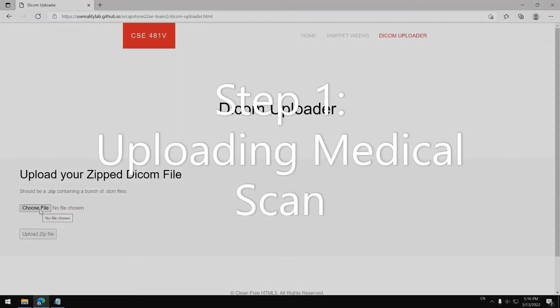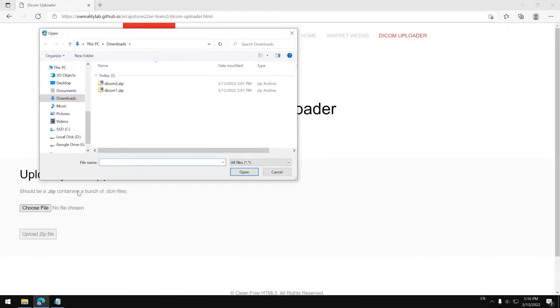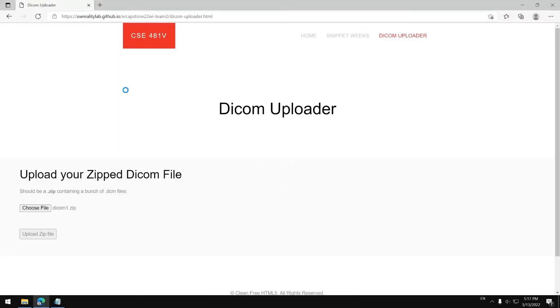The first step in the process is for doctors to upload the DICOM files, which are medical scan files. This website will upload it to a database which will let doctors grab it later on in our app.